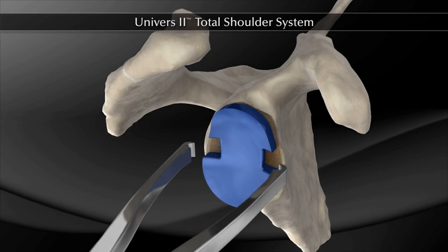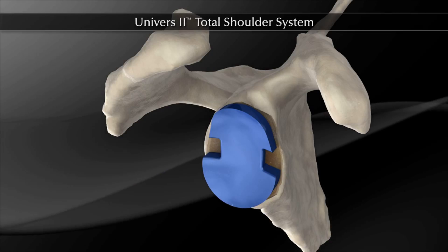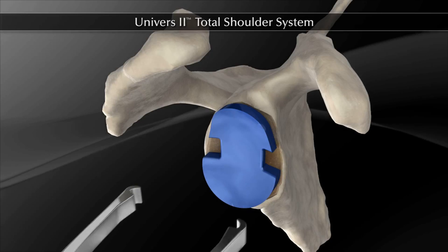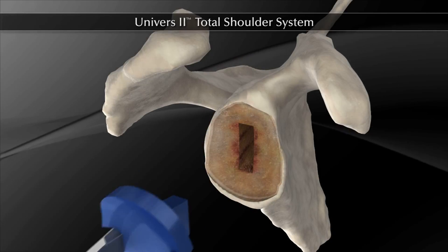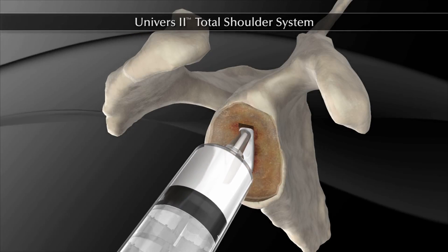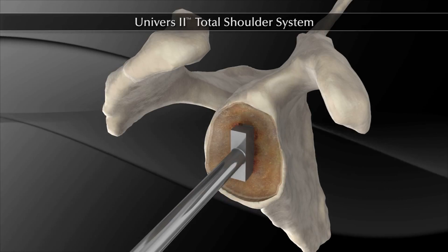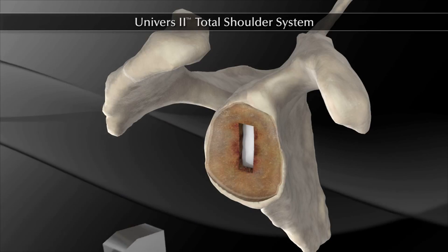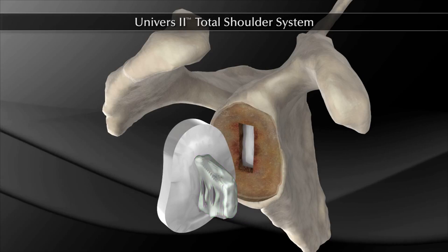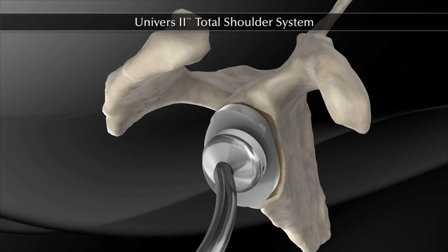A mallet is used to advance the glenoid punch into the roughly prepared slot. The trial glenoid of appropriate size is inserted. Verify that the trial is fully seated against the glenoid surface to ensure proper fit of the actual glenoid implant. The glenoid trial can now be removed with the trial forceps. Once the glenoid has been fully prepared, the bone slot is packed with cement to create good cement interdigitation within the glenoid vault. The appropriate size glenoid implant is opened and bone cement is pressed into the fenestrations on the implant keel.